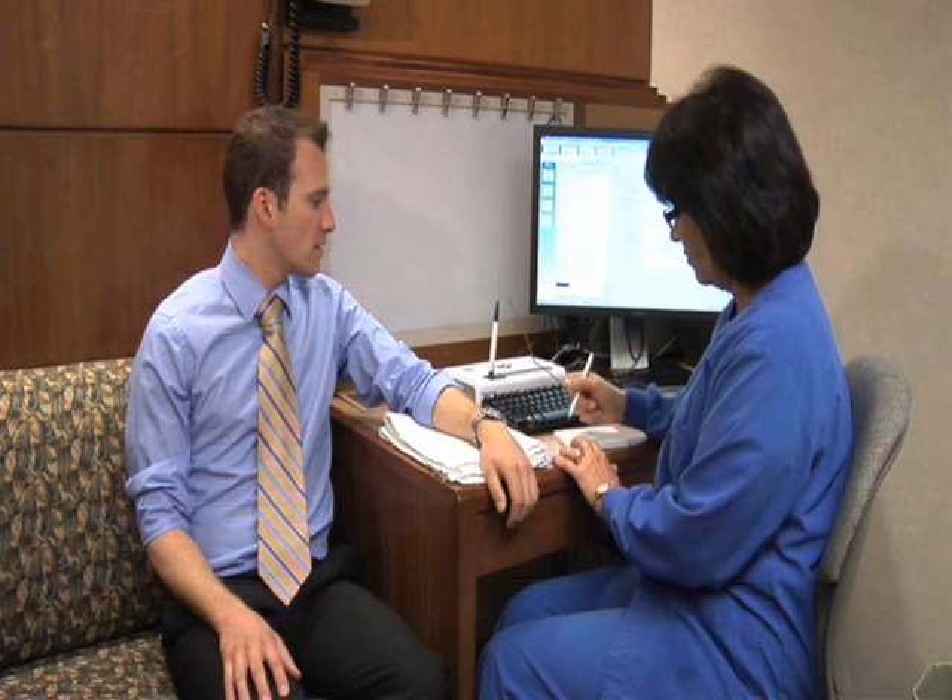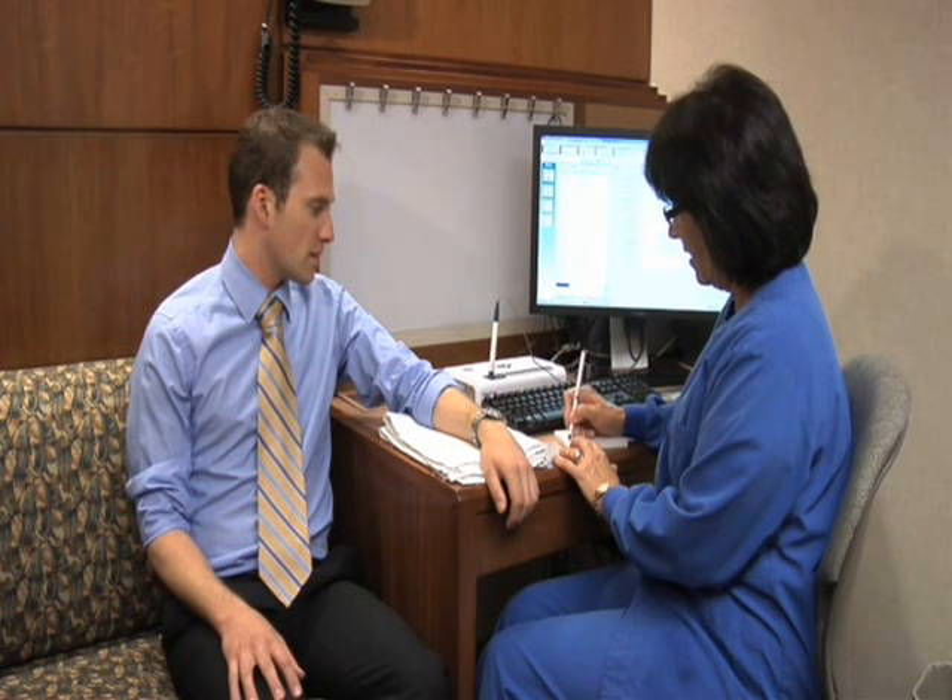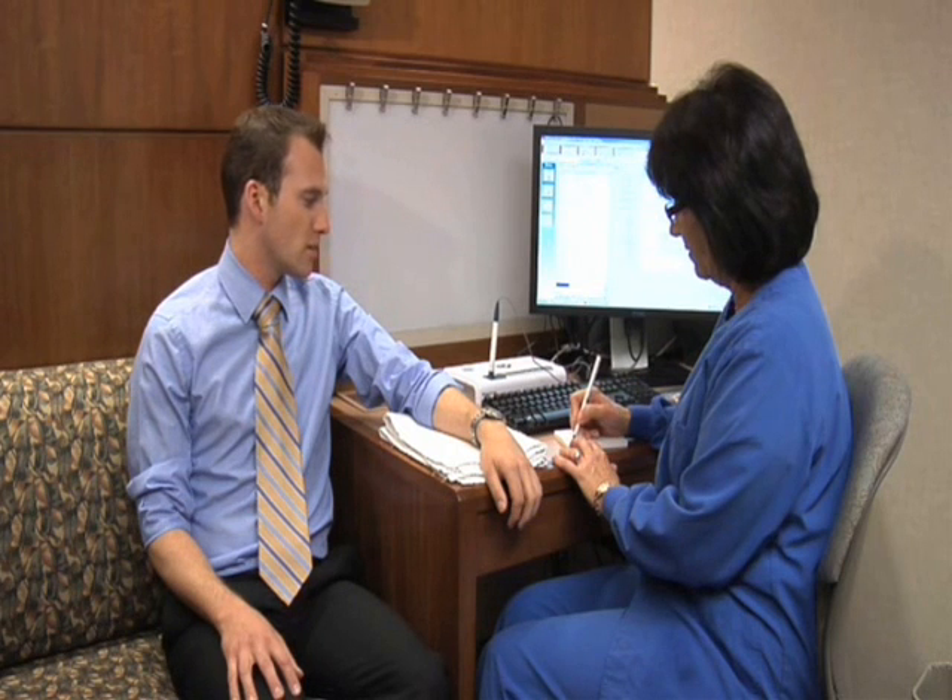I have a couple of questions before I begin that process — I need your height and your weight. It's 172 centimeters and 63 kilograms. And have you been fasting today from caffeine products? Yes. And are you currently taking any prescription medications? No, not at all.